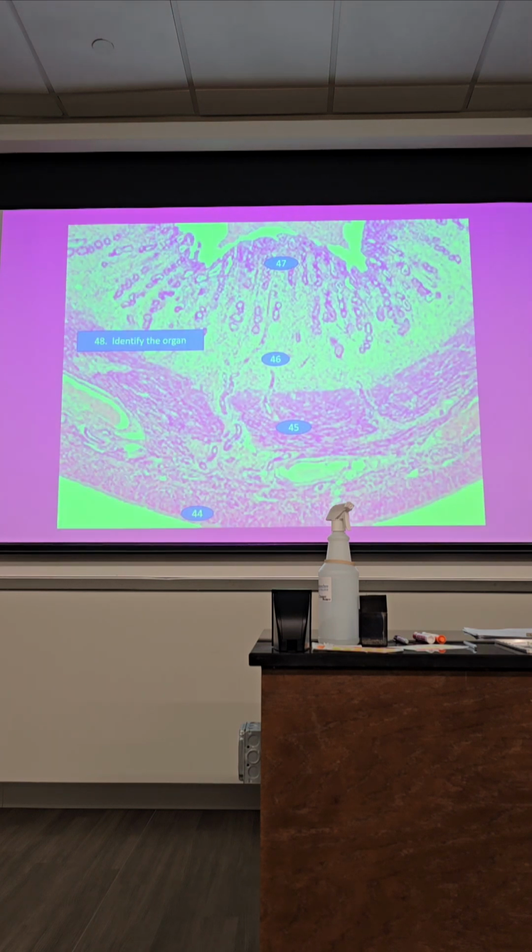Okay, who could tell me what this one is? Bladder. Okay, now what we're seeing here is a bunch of glands. So these are uterine glands, a whole bunch of uterine glands. Now your slide is blue in color, but you see a whole bunch of these, right? So what is this slide of? The uterus, okay? So this is uterus.